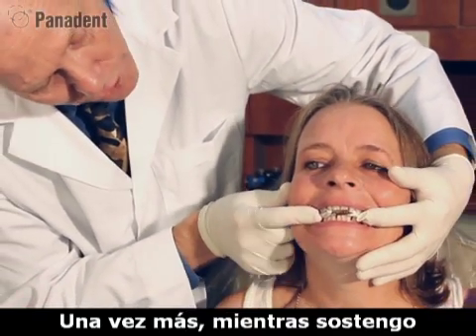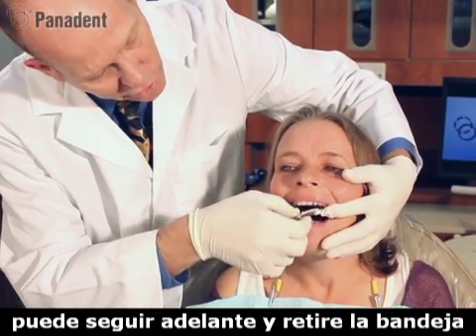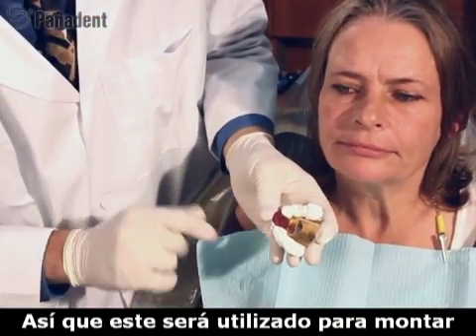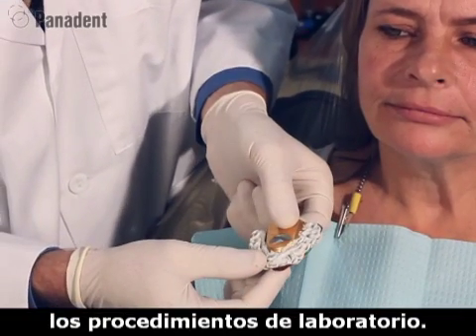Again, while I hold the tray against the upper teeth, have the patient open their mouth. Now I can go ahead and remove the tray. And we do have registration of the posterior teeth into the bite record. So this will be used for mounting the lower cast when we get to the laboratory procedures.